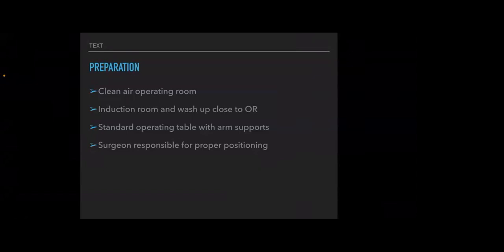So it's very important that before the patient is draped, the surgeon should at least have a look at the position of the table. He should see to it that it is well centralized, it is well perpendicular, the whole pelvis is perpendicular, and it is well fixed. It should not be loose by the end of the surgery, because you have to do a lot of hammering, a lot of movement of the limbs. The whole pelvis may sag, so your version may change.